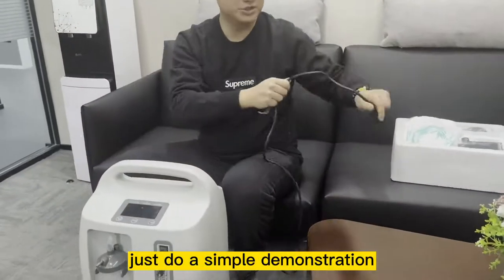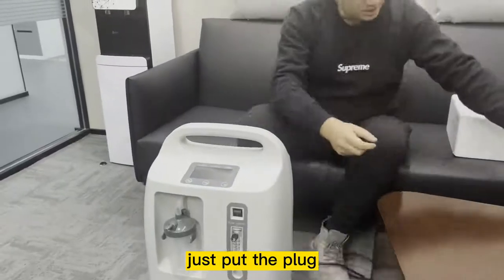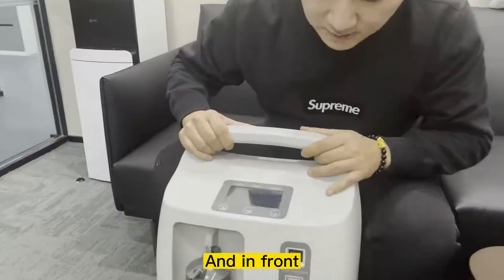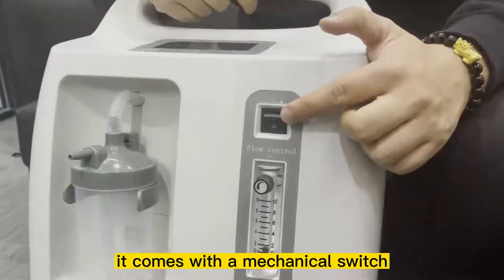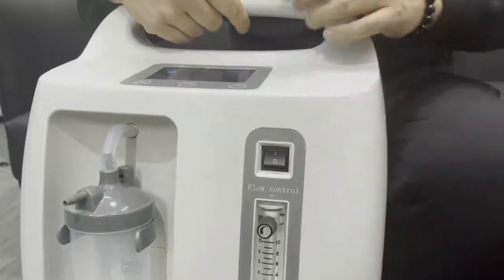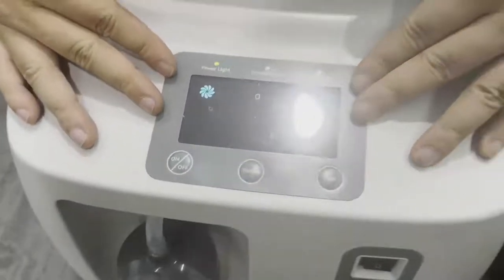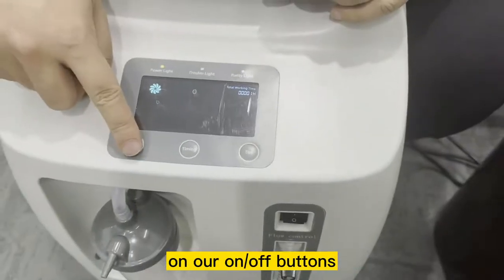I'll just do a simple demonstration. Just put the plug adapter into a power socket. In front, you will see that it comes with a mechanical switch — turn on the mechanical switch, and you'll see that the LCD screen lights up. The next thing you need to do is press the ON button.